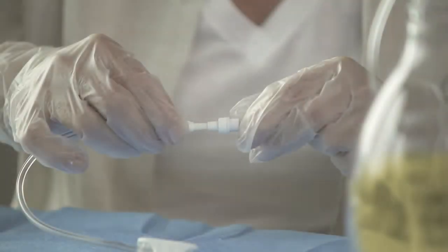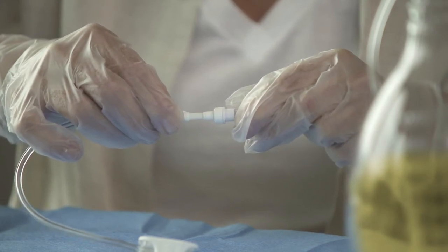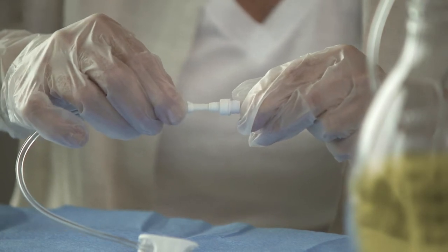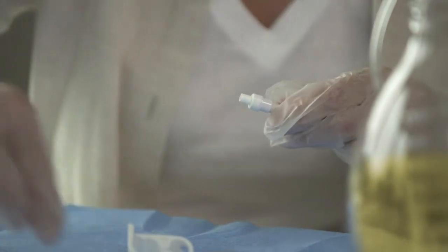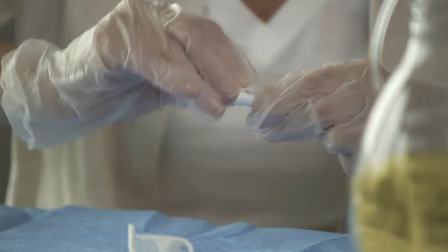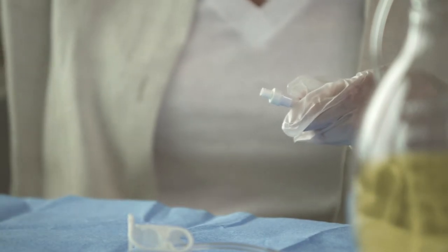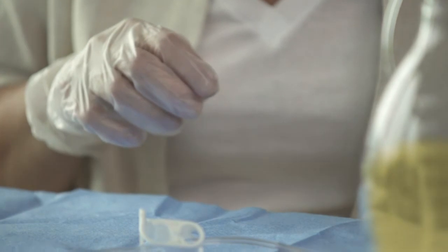When drainage is complete, disconnect the drainage bottle from the catheter by holding the drainage line near the access tip and the catheter near the end. Then, pull the access tip out of the catheter. Clean around the opening of the catheter using a new alcohol pad and twist the new cap into place until you feel a slight click as the cap locks.